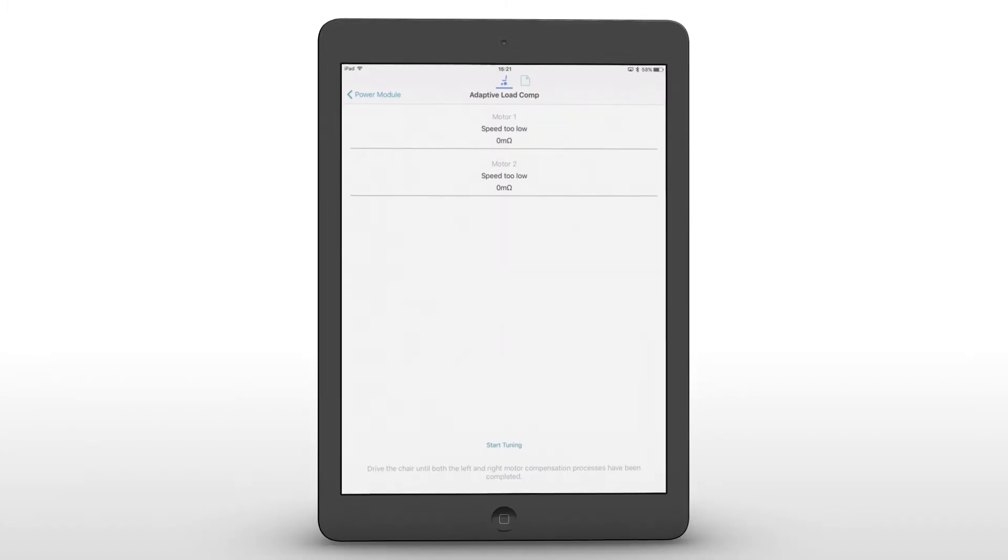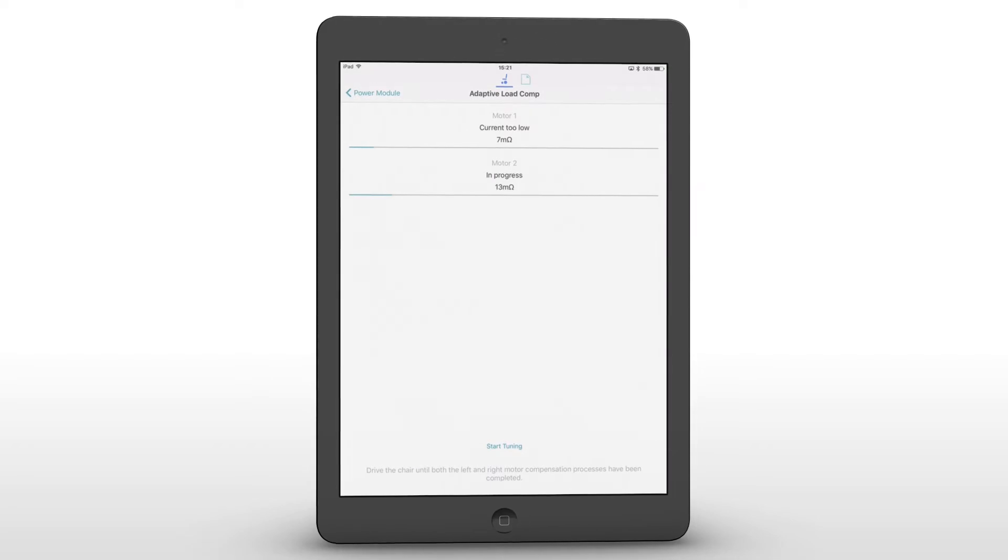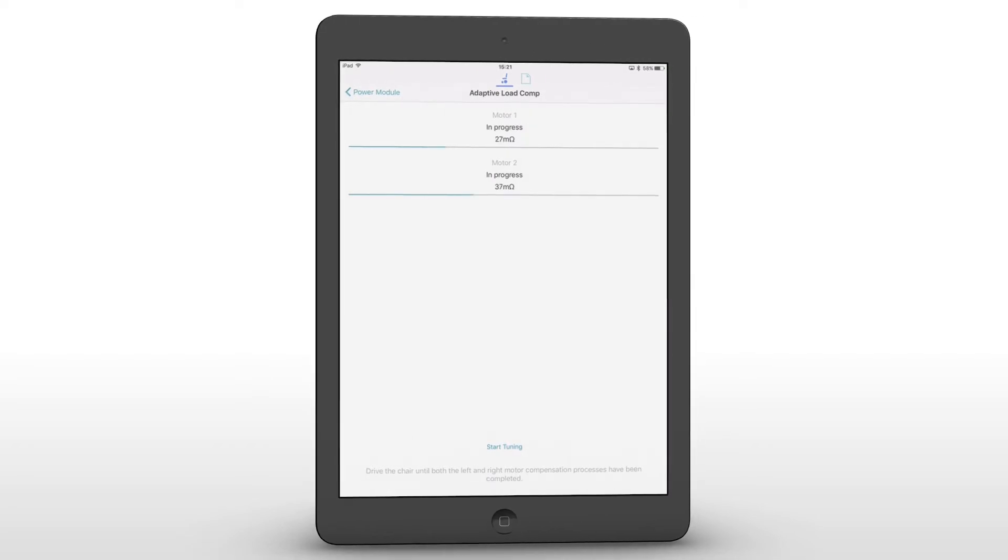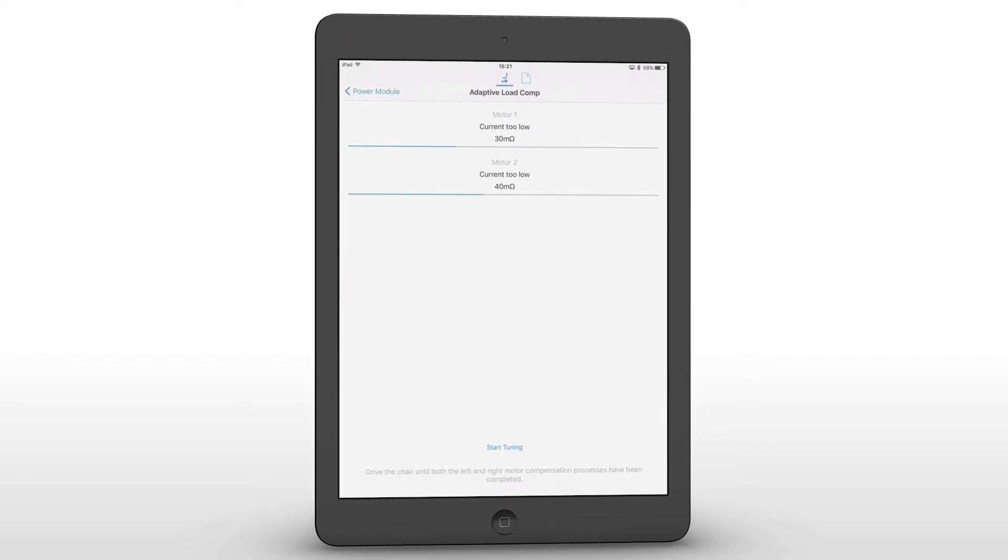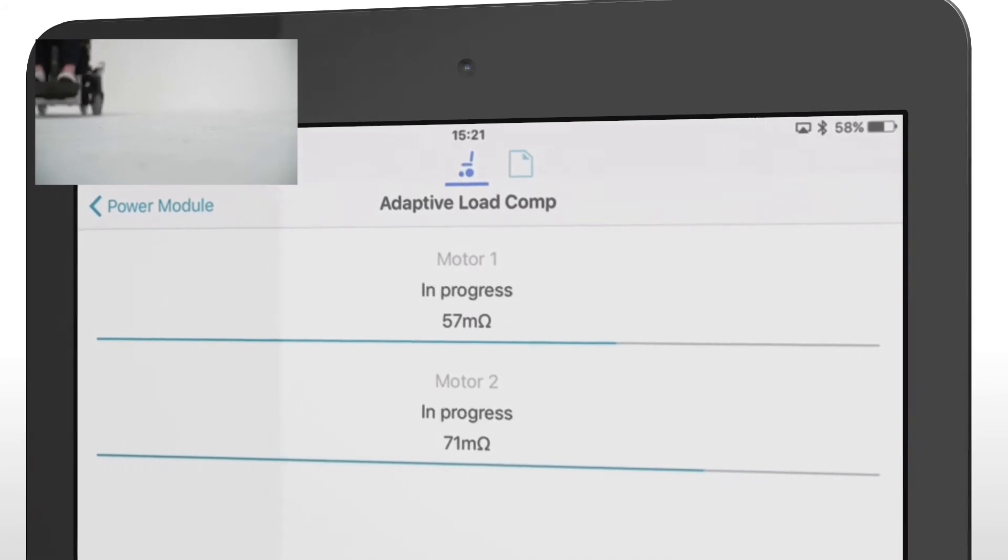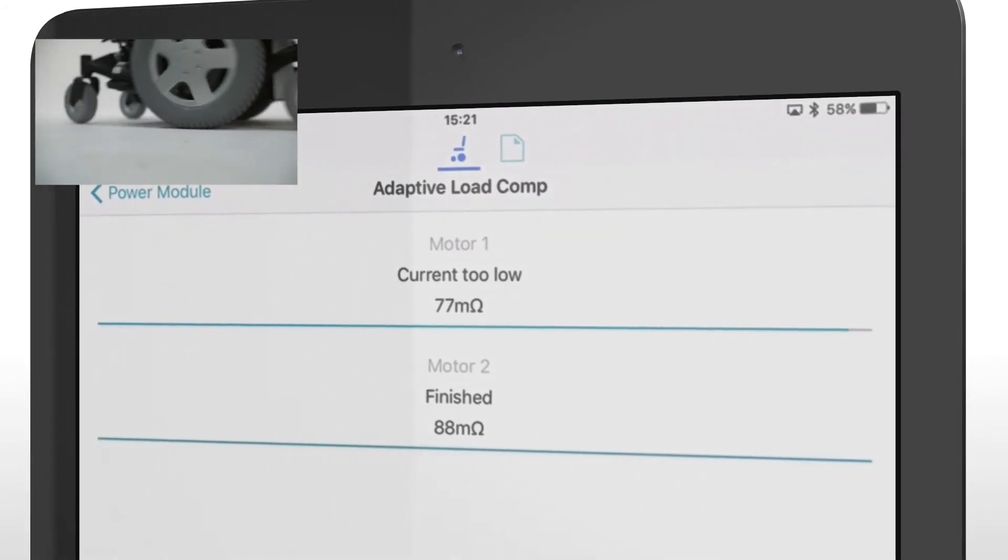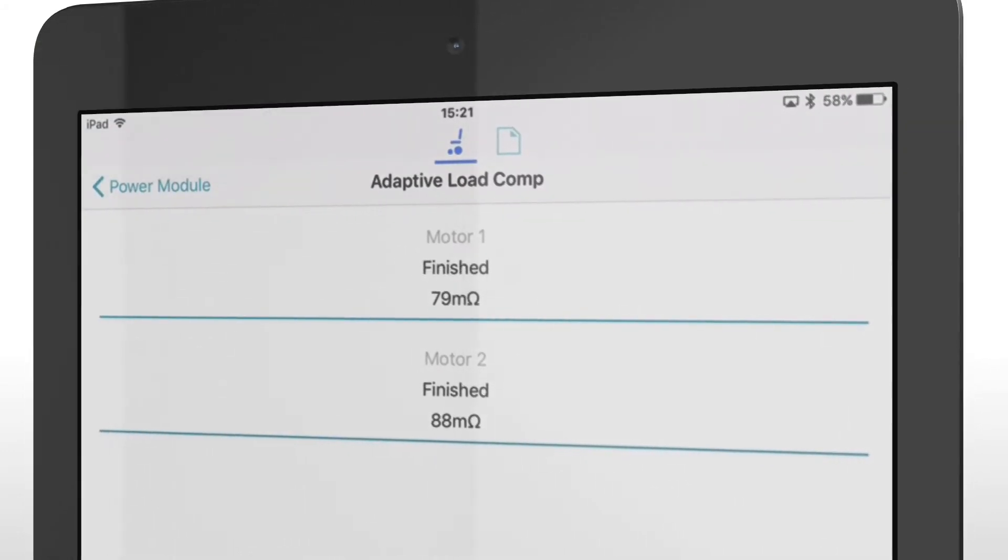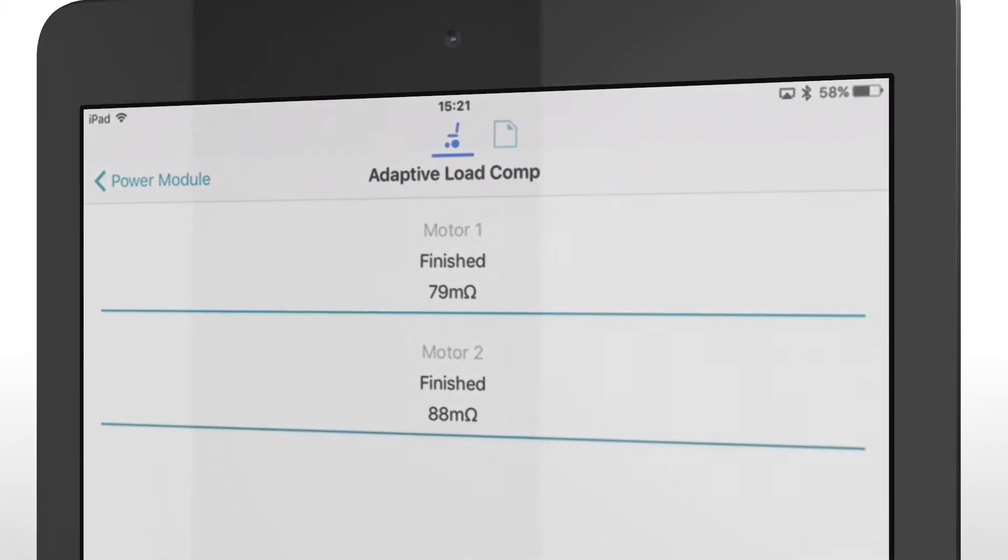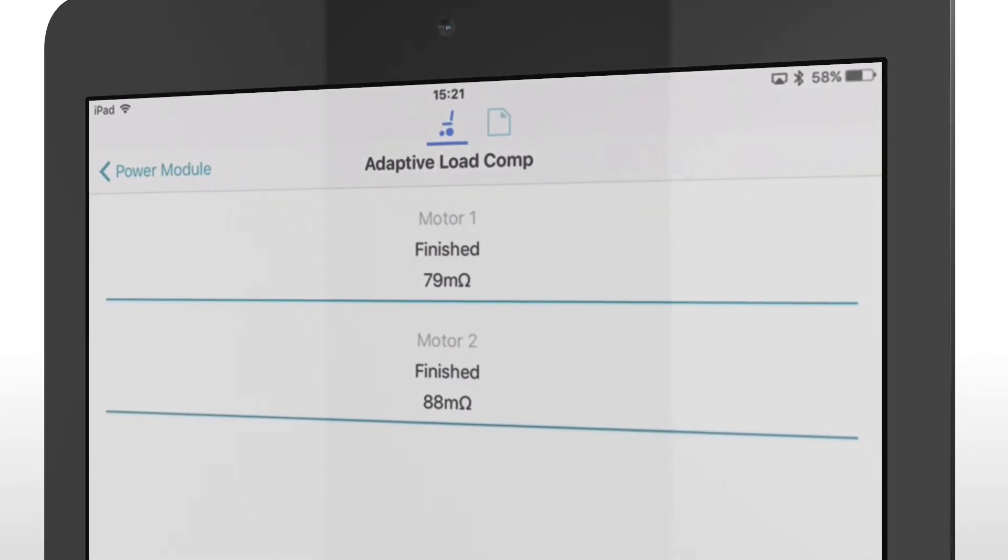Select start tuning to begin a calibration cycle, then drive the power chair until both motors show finished. This completes the process and the revised values are automatically saved to the Lynx controller.